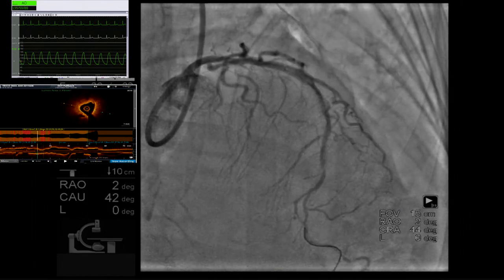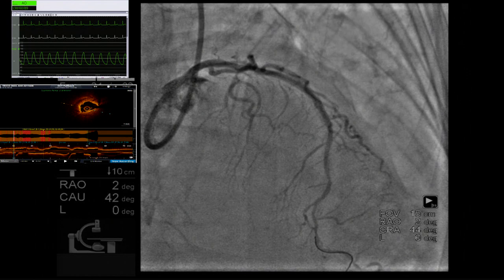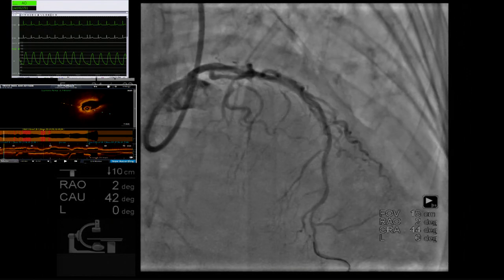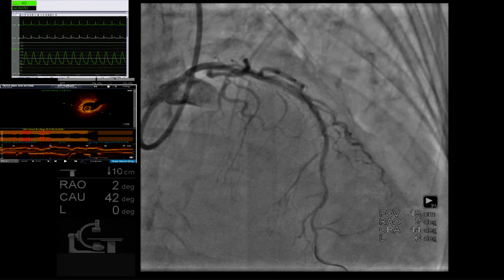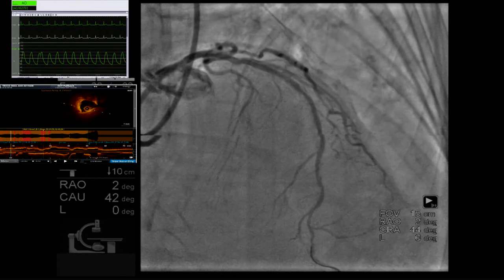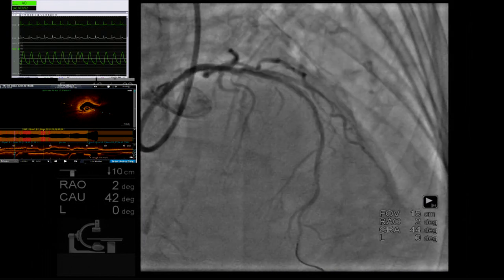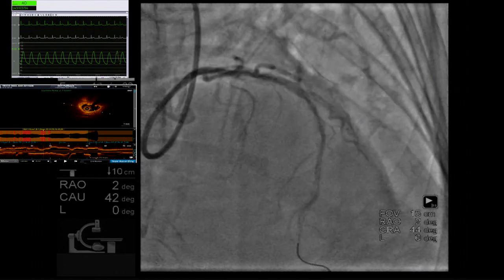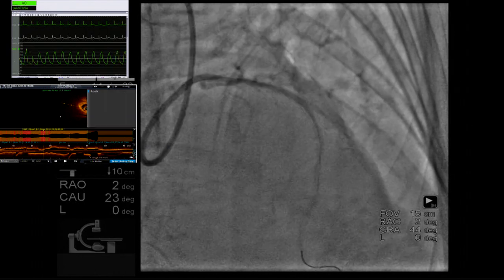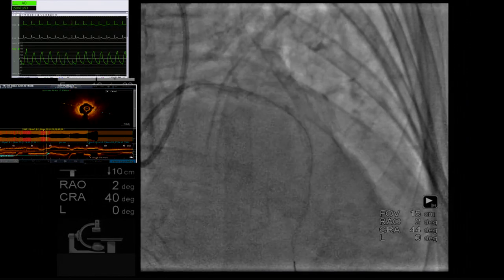There's a little distal angiographic dissection there, so landing zone is going to be right distal to that dissection. That's right. There is some normal segment. We'll do it there. It is hardly 2, but I'll take 2.25 by 26. Okay. Sir, any reason to select Onyx?